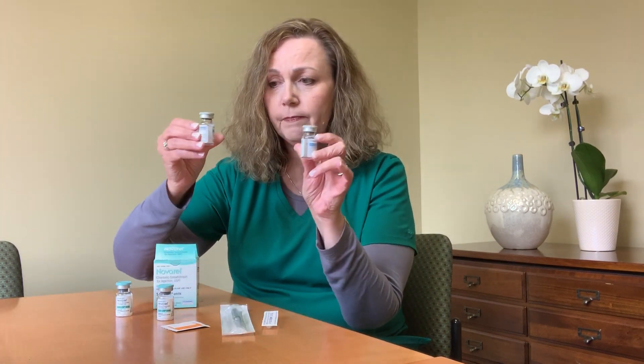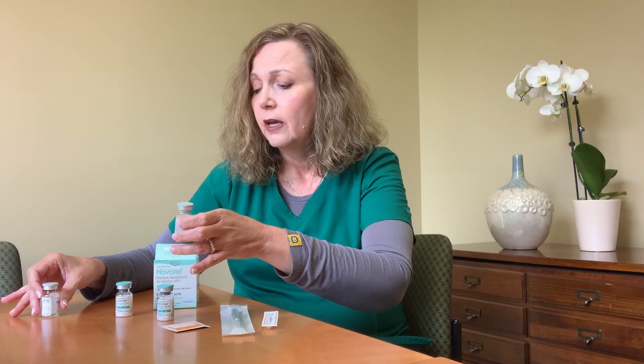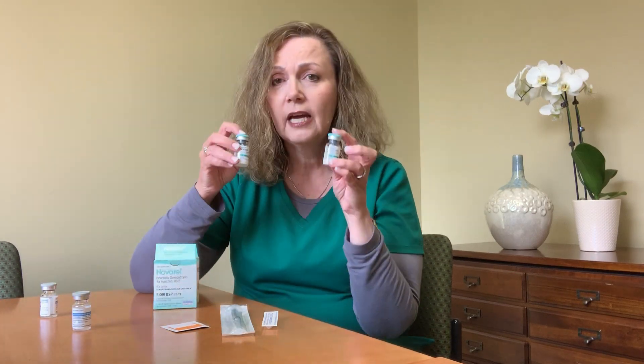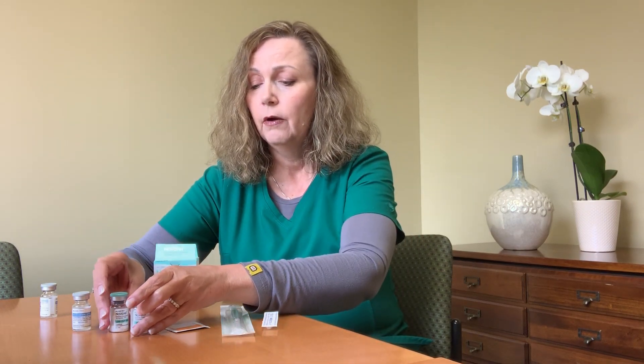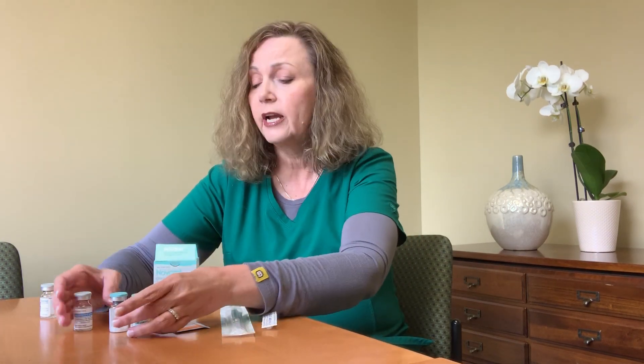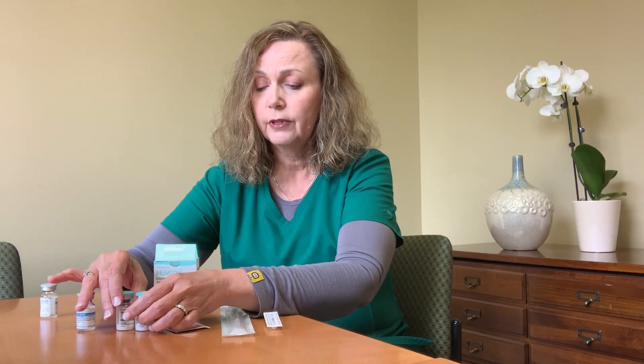First of all, what if your trigger is 10,000? Then you're going to need both boxes of the Novaril. Each one is 5,000 international units. You're going to get both of the vials of diluent but you only need one milliliter, so you don't need that extra one. You do need, however, both of the 5,000 powders. You always want to wash your hands before you administer an injection, and pop the vials of the diluent and both of the powders for the 10,000 dose.